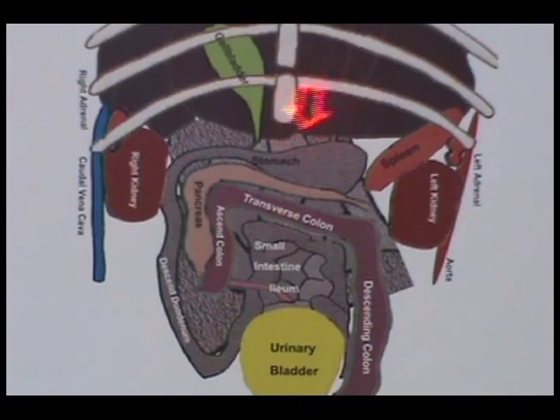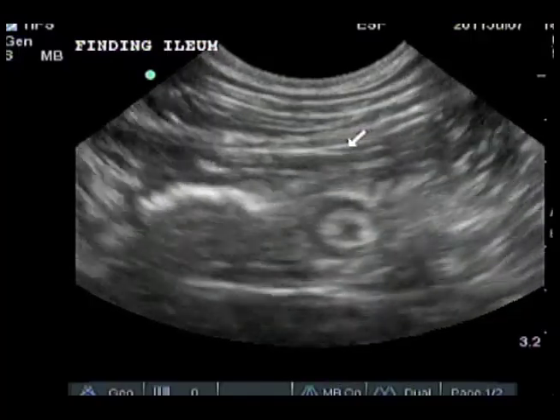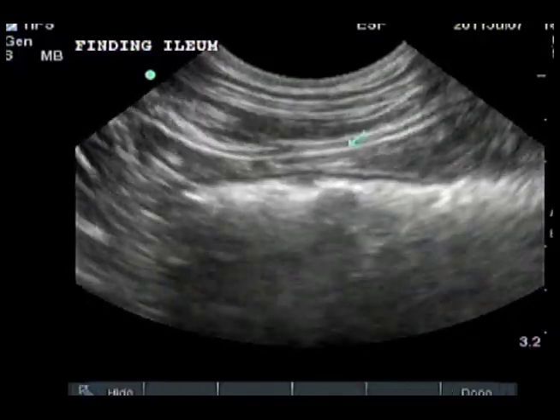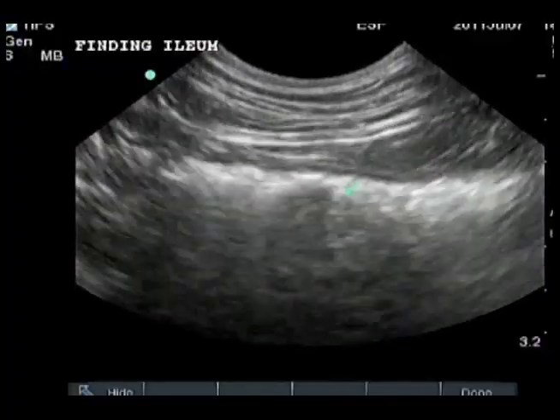Unlike a dog's spleen, which can vary greatly in size, the normal spleen in a cat should always be small. Both kidneys are usually caudal to the last ribs. In cats, the normal ileum is recognizable and quite different from other intestines. The ileum is often seen in the right caudal quadrant of the abdomen and can be followed into the ascending colon. Now let's go through the abdomen one organ at a time.